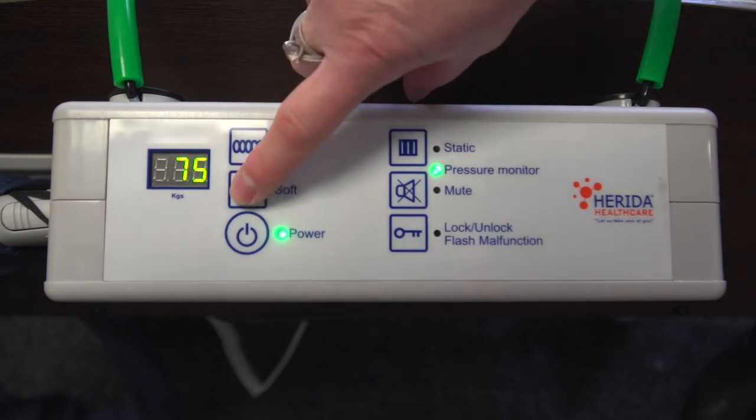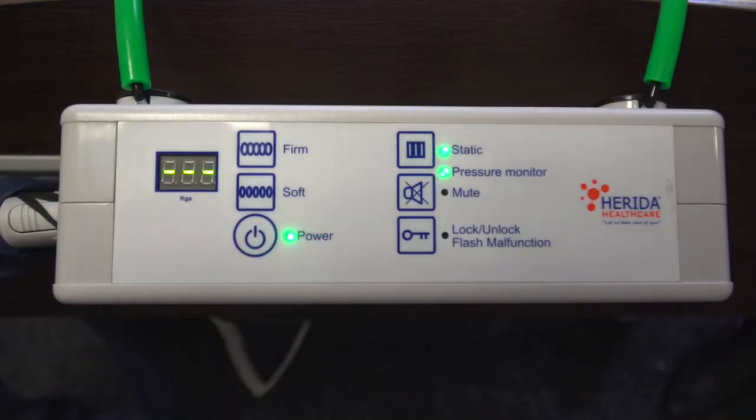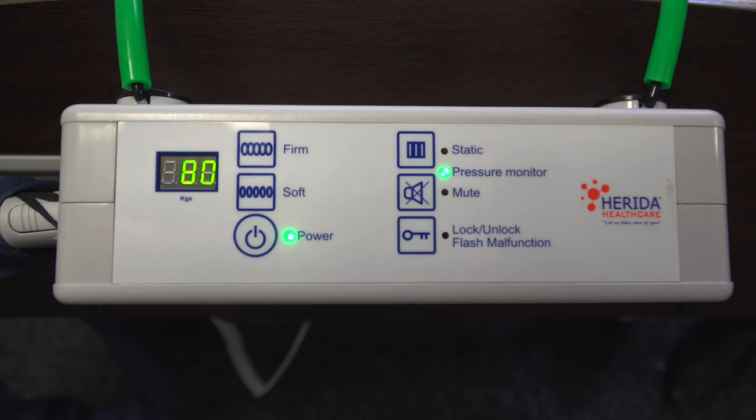Pressing the static button on the pump control panel will stop the alternation cycle, and both sets of cells will remain fully inflated. When the static button is actioned, you will see the top LED light and pressure monitor light illuminated. The static mode allows clinical procedures, site transfers, or any other procedure to occur. If the static mode has been selected as a safety function, the system will revert back to the alternating cycle after 25 minutes. It is better to manually revert back to the alternating cycle once procedures are complete, but the automatic function is there as an additional feature.